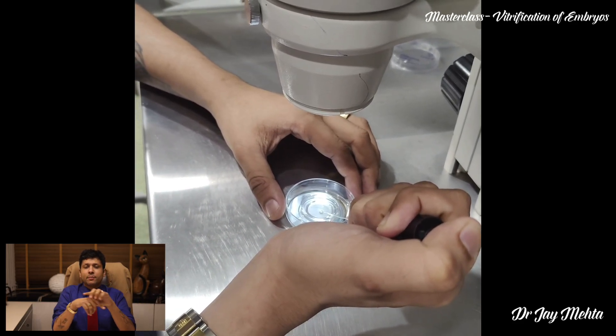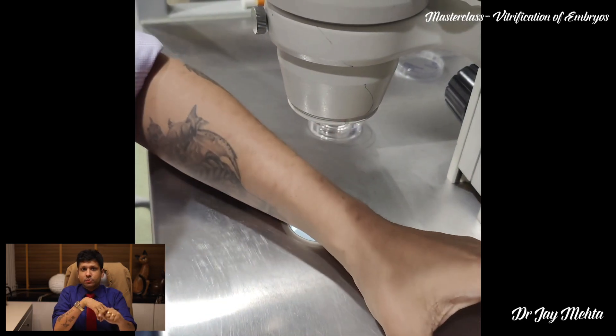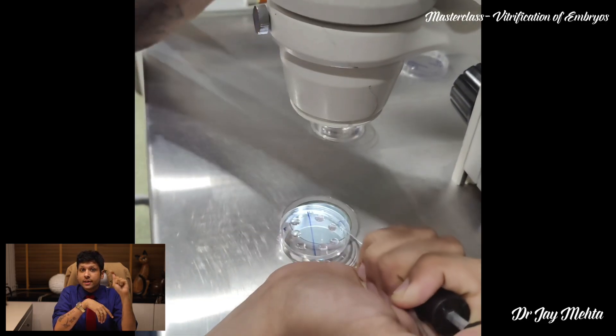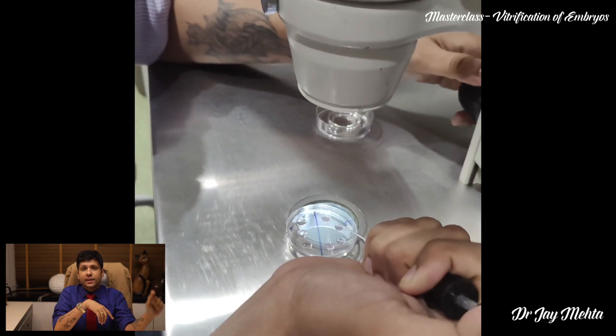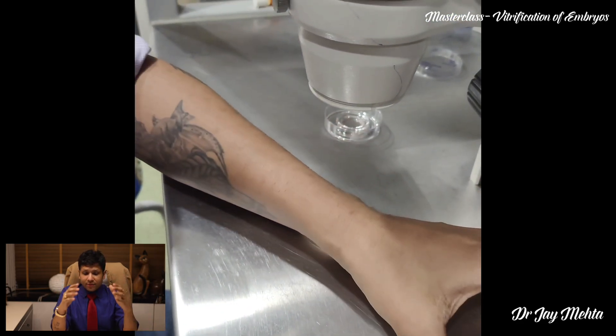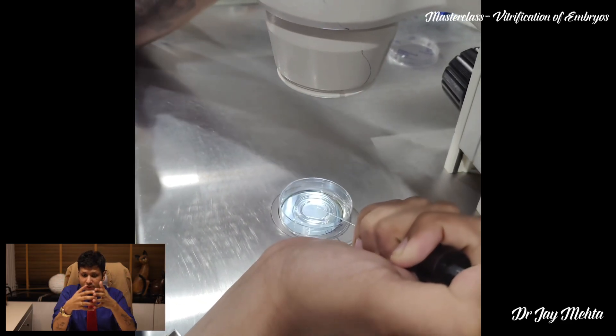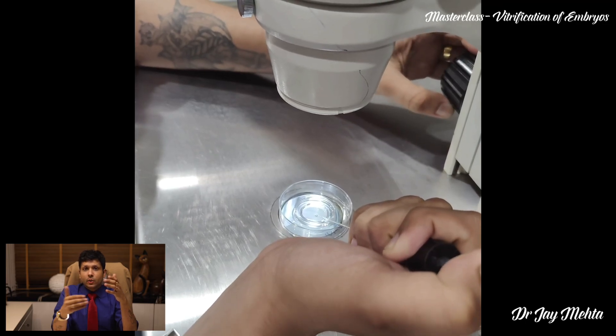As a result of this, the vitrification procedure allows for controlled exposure of cryoprotectants — this is the most important thing. After you have selected your blastocyst embryos, the embryos are then loaded inside the equilibrium drops.